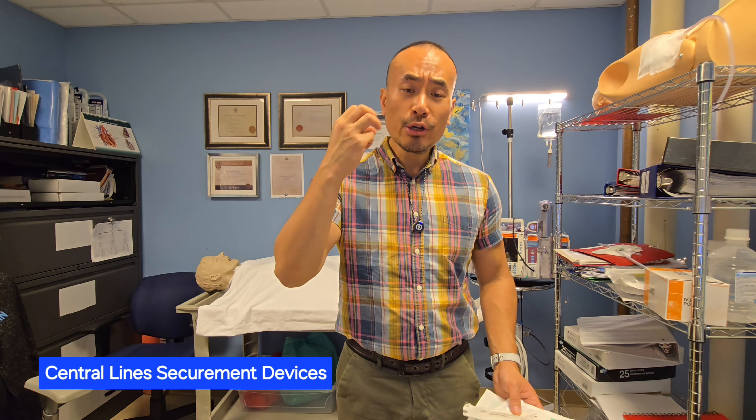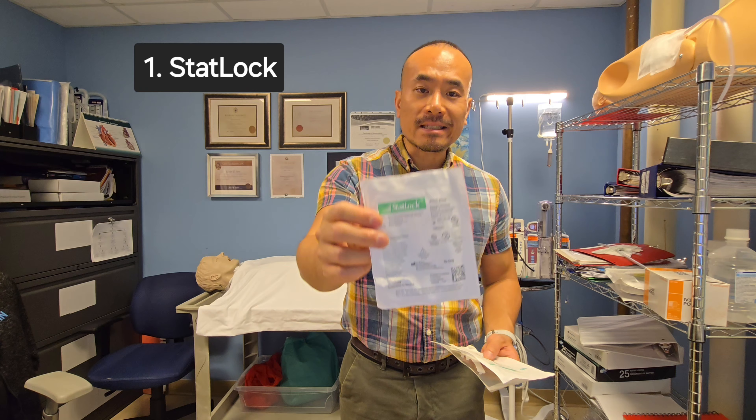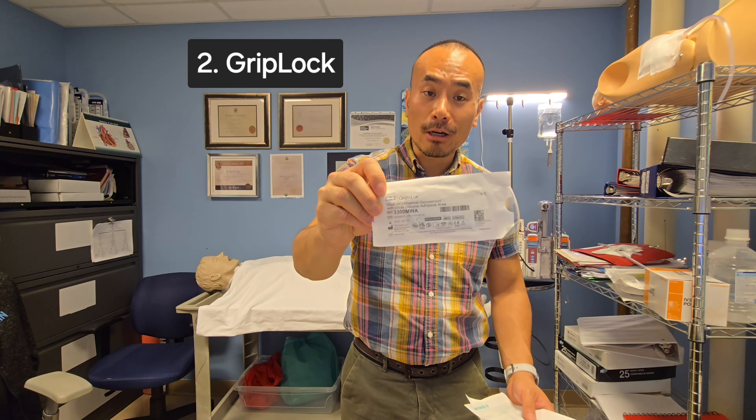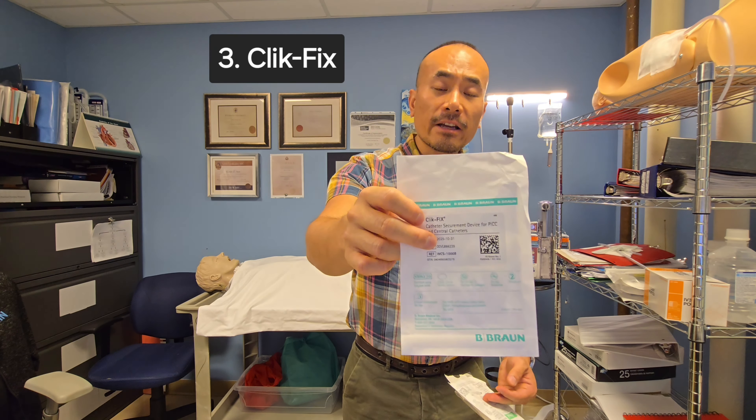Hello everybody, this is Carlos. Welcome to another video. In today's video, we're going to discuss three securement devices for your central lines, namely your PICC lines. The first one is probably the most popular one — the stat lock. The second one is called the grip lock, and the last one is called the click fix. I want to show you how to apply and remove them on our fictional patient right here.